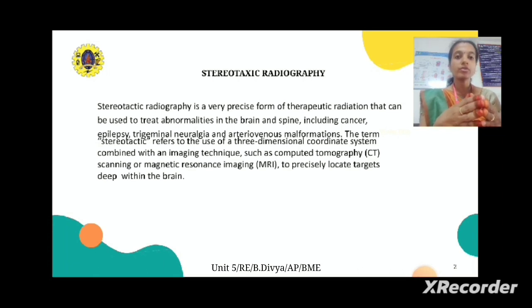Stereotactic radiography is a very precise form of therapeutic radiation that can be used to treat abnormalities in the brain and the spine. It is a type of therapy.